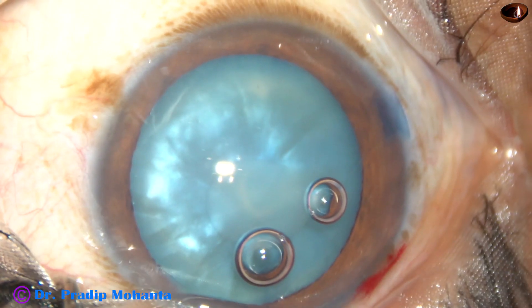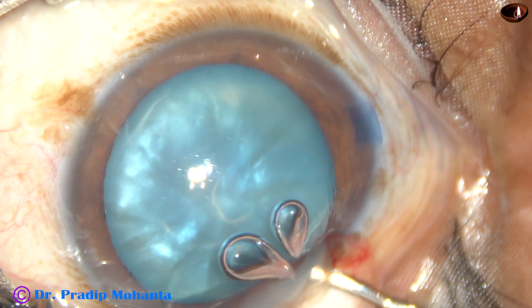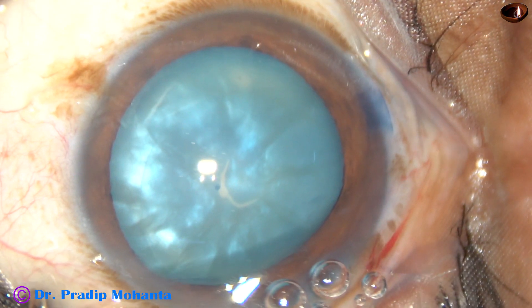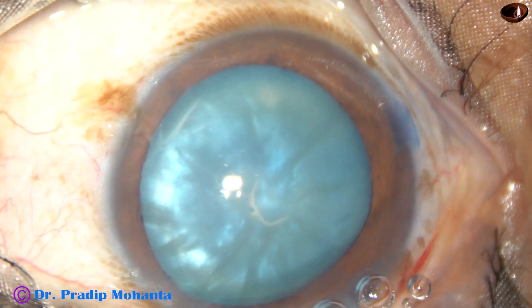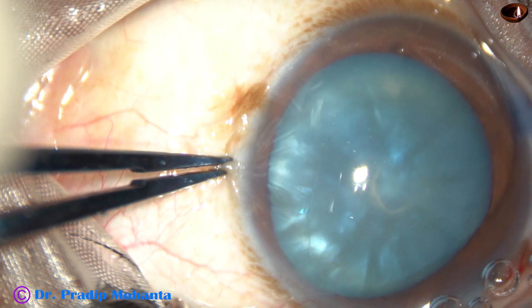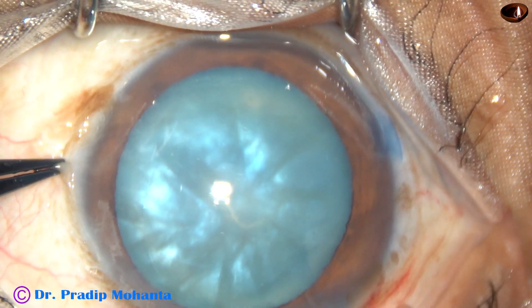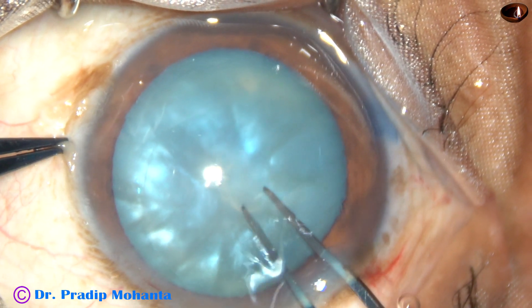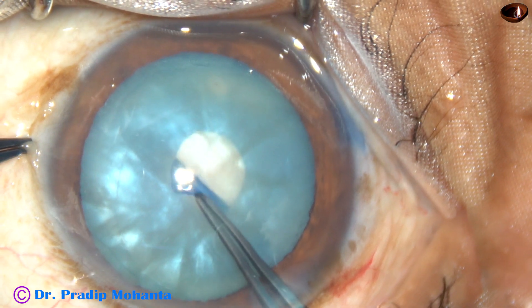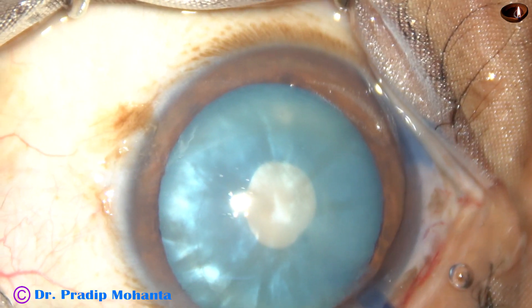You can see some turbid fluid has come out. There are some air bubbles. Depress the posterior leaf and let the air bubbles come out. Now take a forceps and convert this C-flap into a small rhexis. I call it a mini-rhexis. So, the mini-rhexis is done.